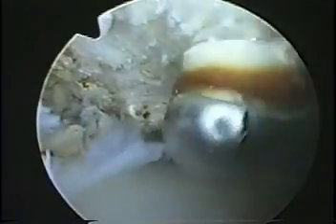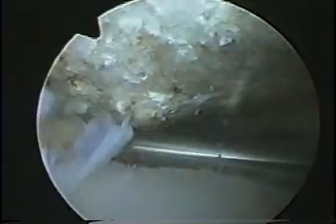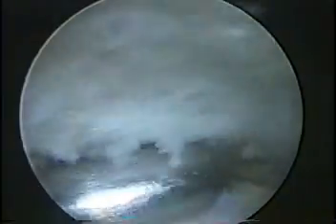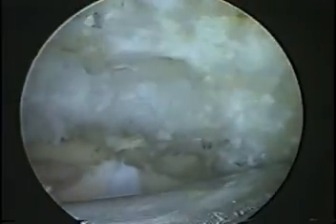Once the acromion has been thoroughly debrided, it is important to assess the size and shape of the acromion. With the arthroscope through the lateral portal, a blunt trocar can be passed from the posterior portal and the acromion literally palpated and the shape and size assessed. In this case, a type 3 acromion is evident utilizing the blunt trocar, and this type 3 acromion will be shaped to a type 1 morphology.